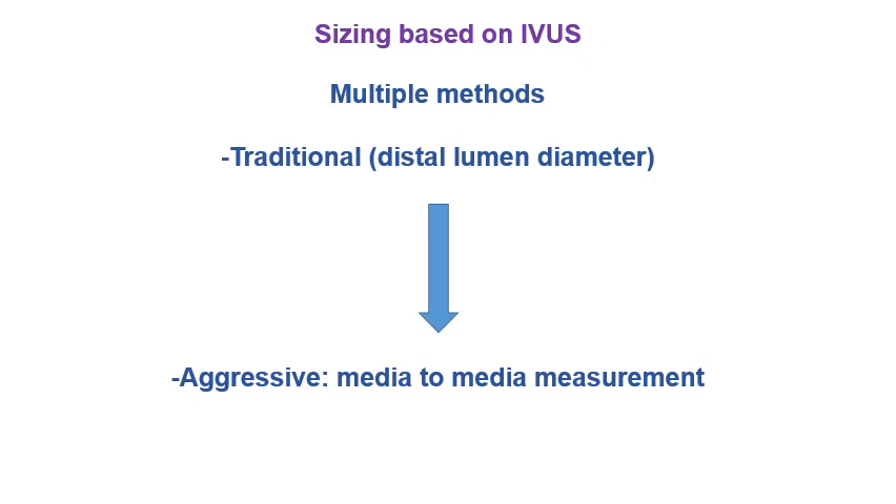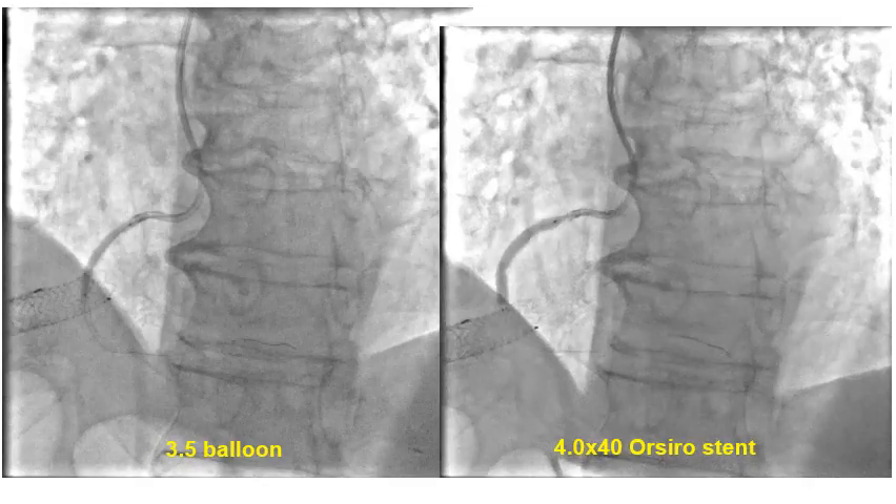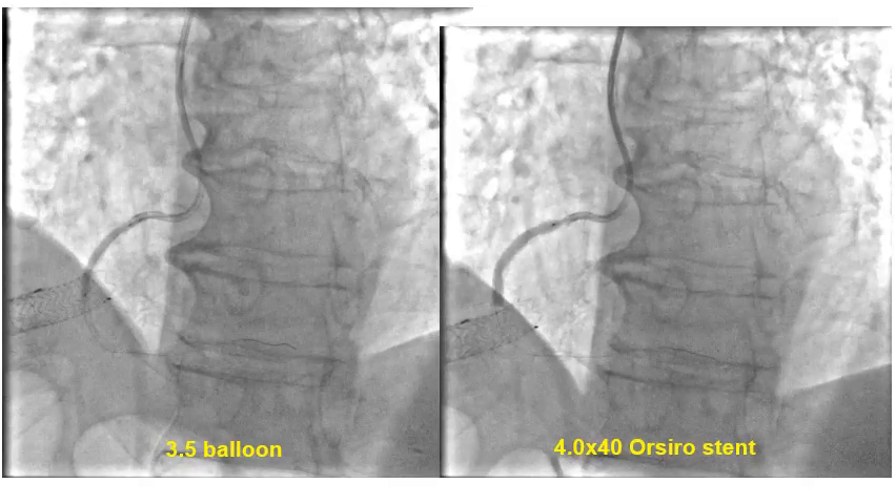A few words about stent sizing based on IVUS. There are multiple methods: starting from the most conservative, using the distal lumen diameter as the stent size and then using multiple balloons to post-dilate proximally, up to the most aggressive, which uses the media-to-media measurement. We chose a method in the middle and used a 4.0 by 40 millimeter Orsiro stent to cover the whole lesion.